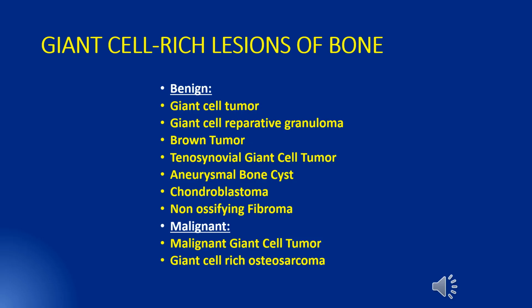So I'm going to talk about the most common benign and malignant giant cell lesions of bone. I will mostly focus on histopathology and new molecular findings in these lesions. The next talk by Robert Boutin will focus more on radiology.